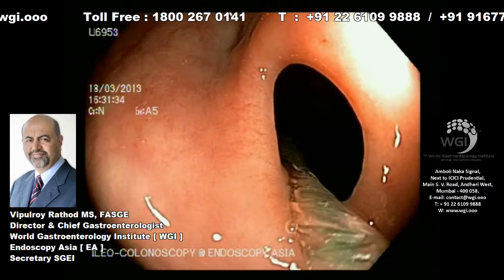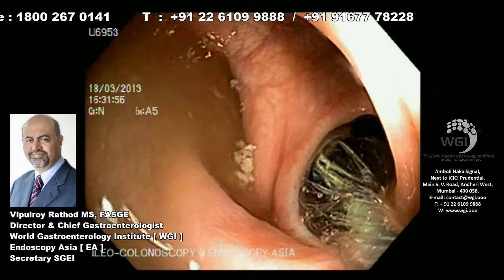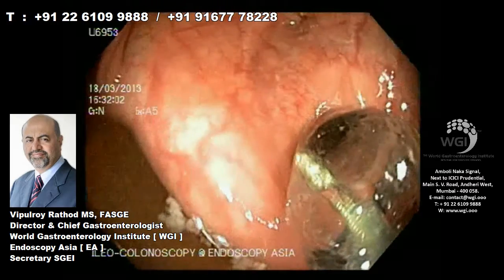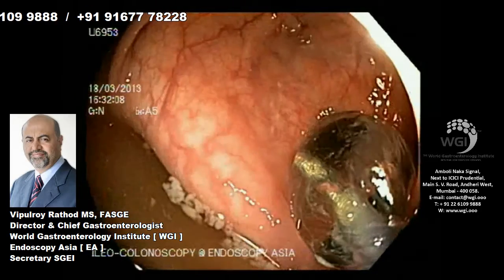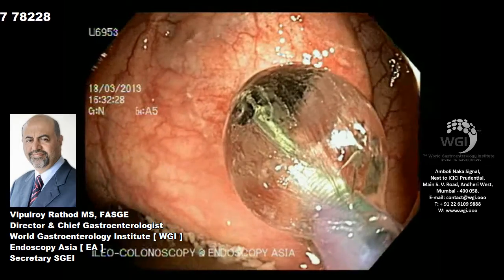What we're doing here is taking a through-the-scope balloon, which is a 15-millimeter balloon, and we dilate the stricture up to 7 atmospheres. This should be kept in place for at least 1 to 2 minutes to achieve controlled radial expansion of the balloon and meaningful dilatation of the benign stricture noted at the recto-sigmoid junction.